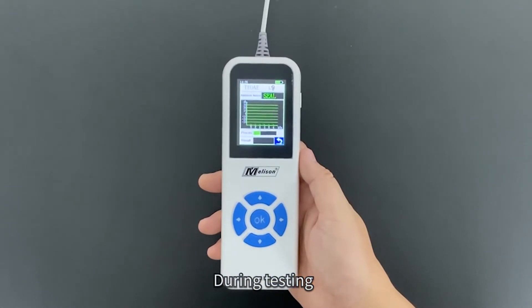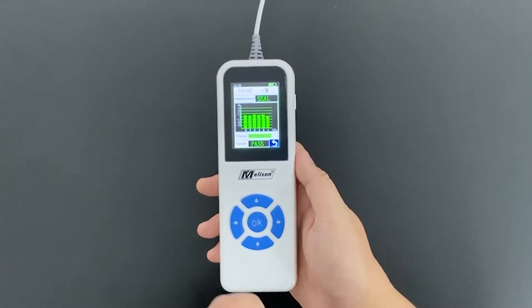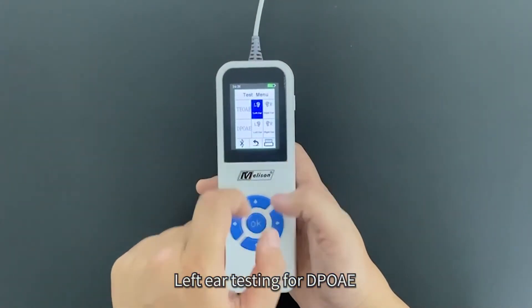During testing, if the result shows pass, it means the test has been passed. Then proceed to left ear testing for DPOAE.